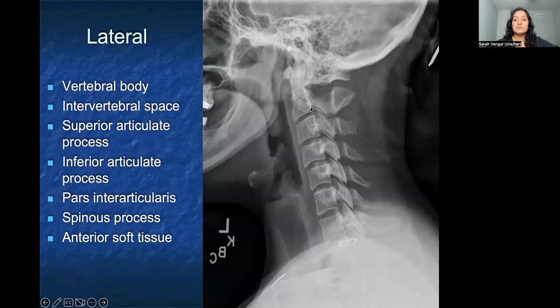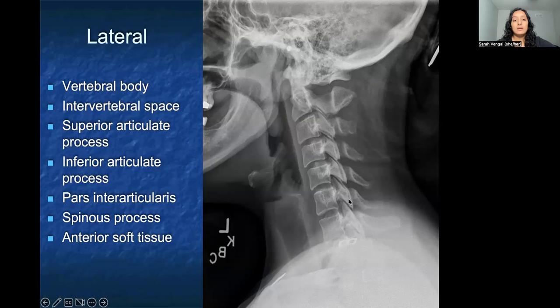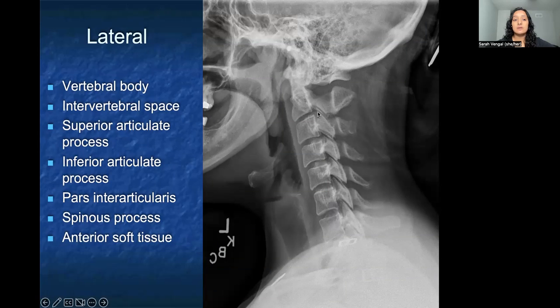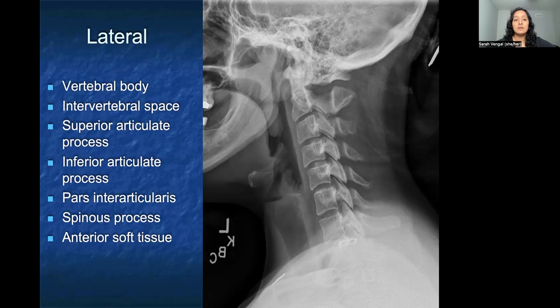On the lateral view, I again start by assessing each vertebral body to confirm they are maintaining their relative height, space, and shape. I also look at the intervertebral space to make sure that is maintained. The lateral view lets you examine how the vertebral bodies are joined — you can see the superior articular process, the inferior articular process which joins with the vertebral body below, and in between is the pars interarticularis. This has a lot to do with the motion of the cervical spine. You can also assess whether the space between these processes is maintained or narrowing.